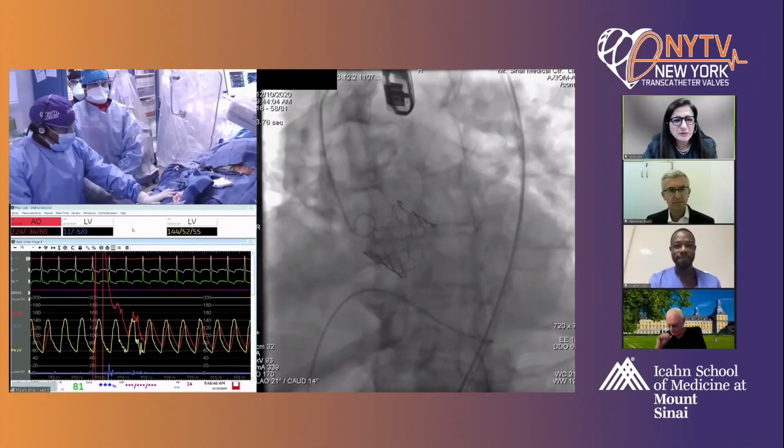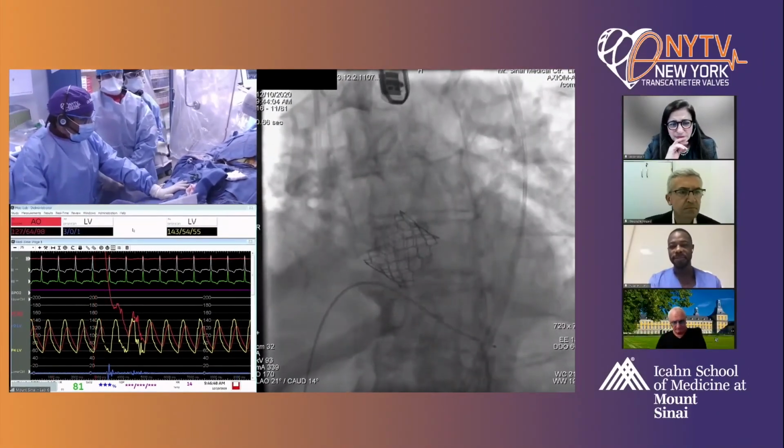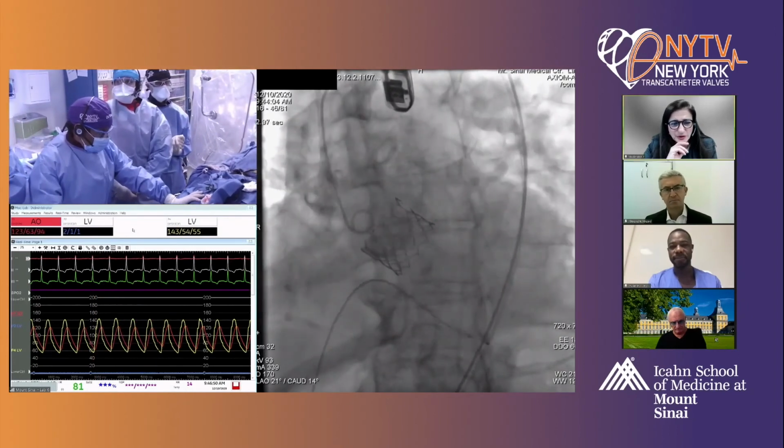I like to implant these valves in a little bit higher position. Yeah, we noticed that.